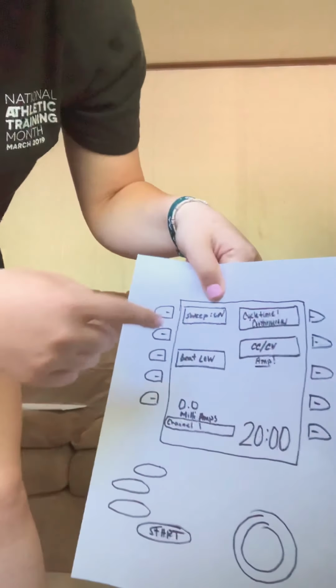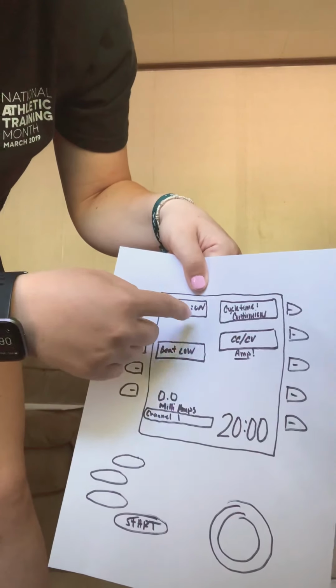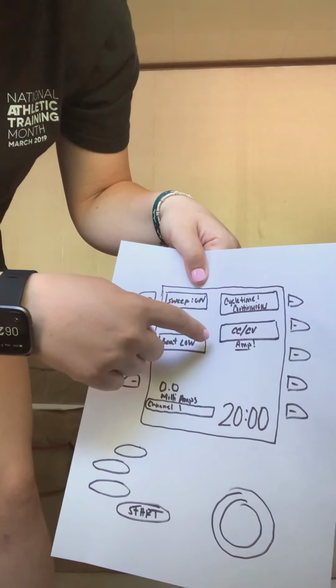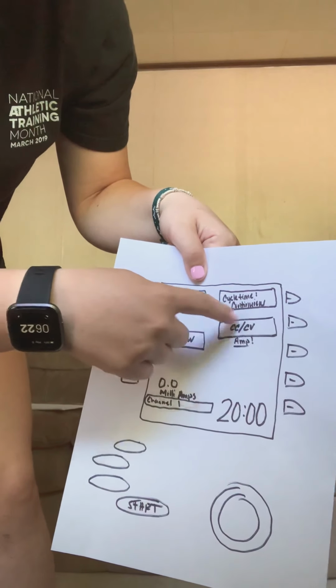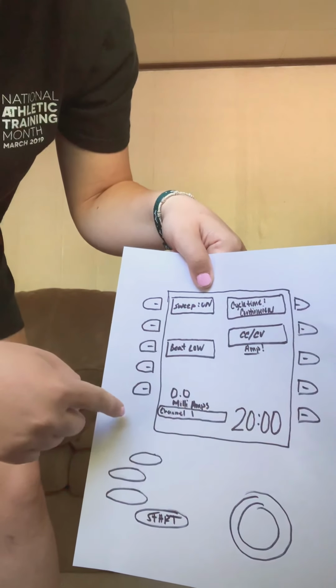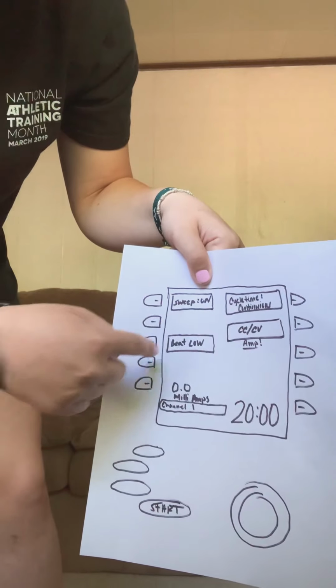So I want to go ahead and keep my sweep on. My cycle time I want to be continuous. For my current, I want it in amps. So down here, once you change it, it should say milliamps. And then I want my beat to be low. Your beat and your current will be the same. I went ahead and changed my time to 20 minutes as well. That's how long I want this treatment to be.